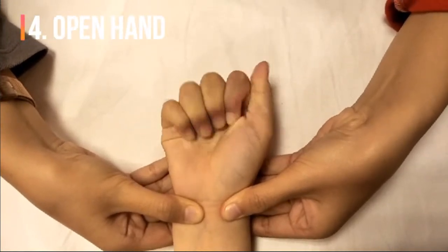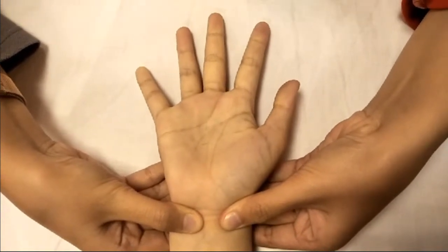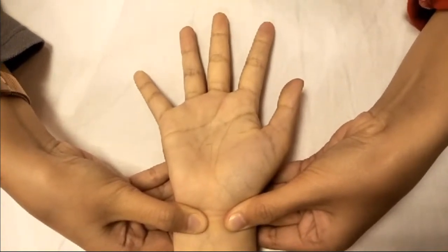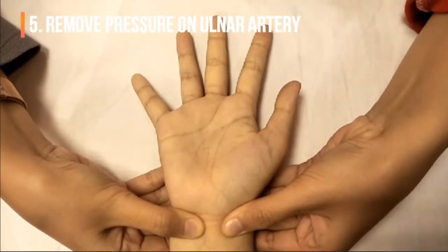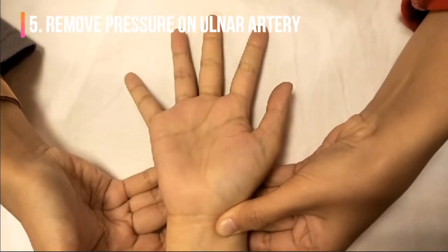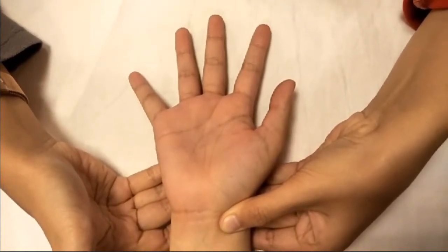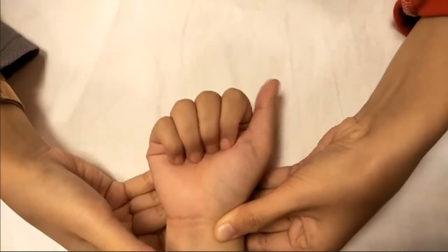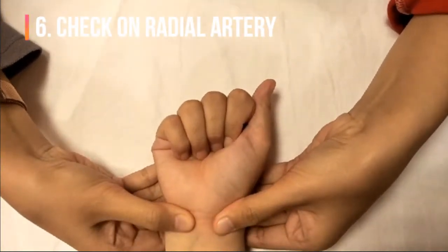Open up your hand. The palm and fingers should look pale since the blood supply has been cut off. The nurse or doctor will remove pressure on the ulnar artery only to check how quickly color returns to the hand as blood flows through a single artery. He or she will then check the radial artery flow by pressing on the ulnar artery.